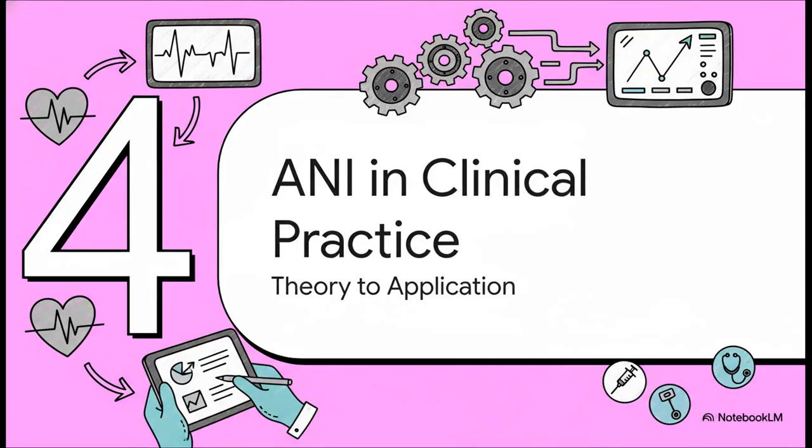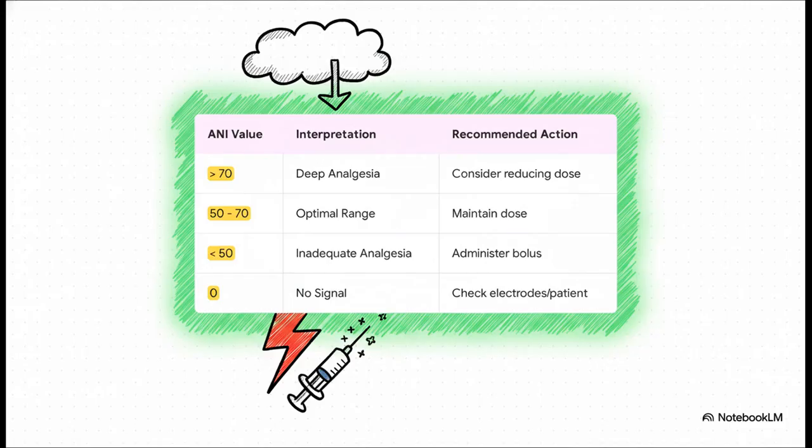All right, enough with the studies for a minute. Let's get practical. How do we actually use this thing in the OR? How do we take this number and turn it into real-time decisions that help our patients? Think of this table as your go-to guide, your clinical playbook.